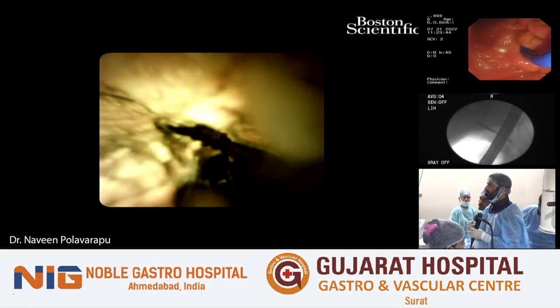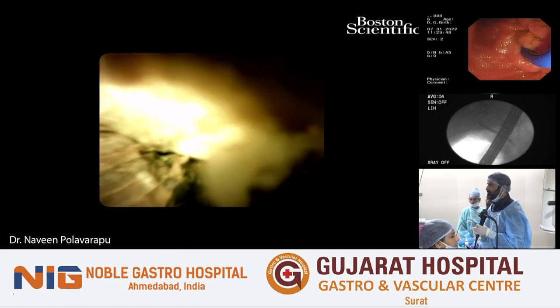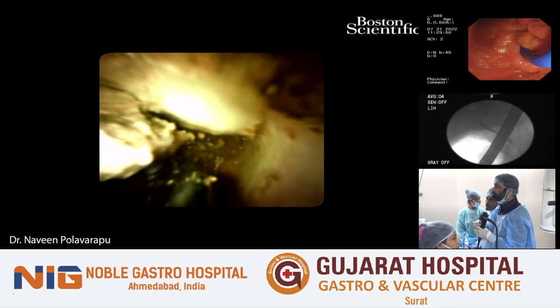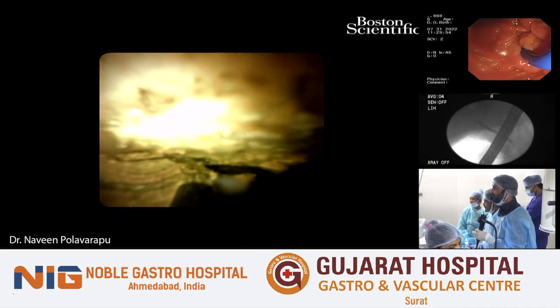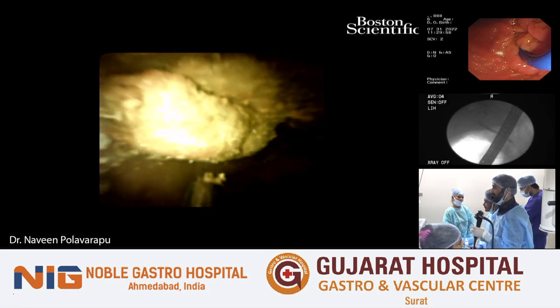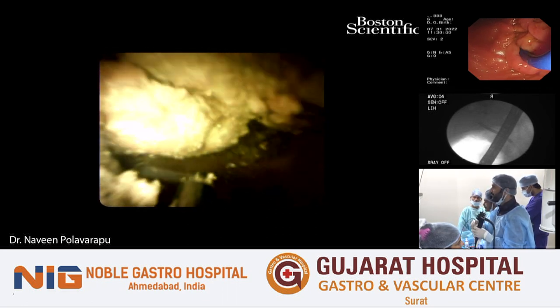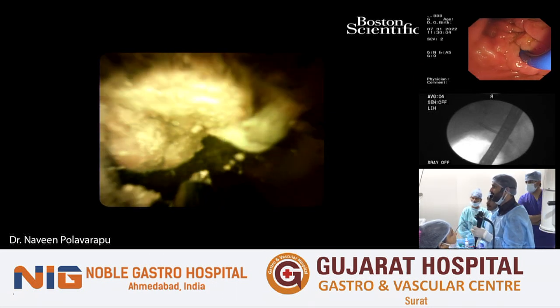I would say put the pulses at 5 and then use a low power to start with. If you have a very big hard stone, then you can gradually go up to even 15. The settings on the EHL say you can go even up to 30. But I think 15 is good enough. We should be able to break the stones with a 15 setting.